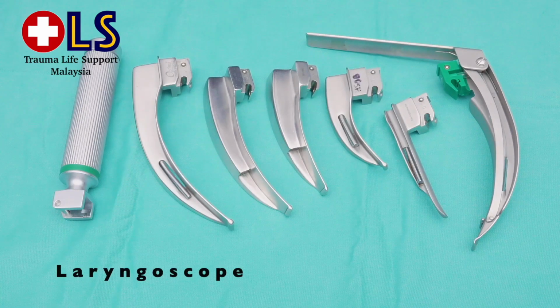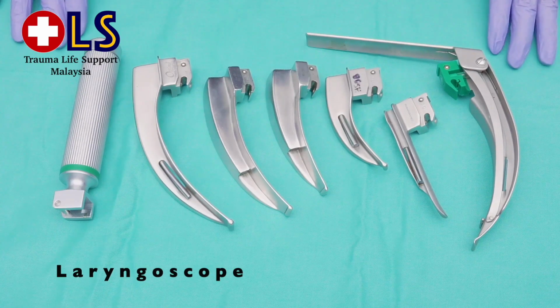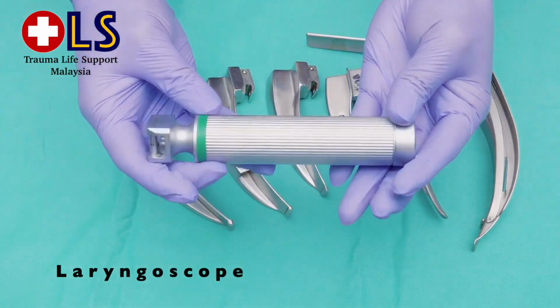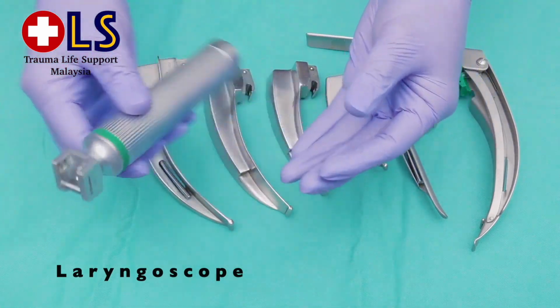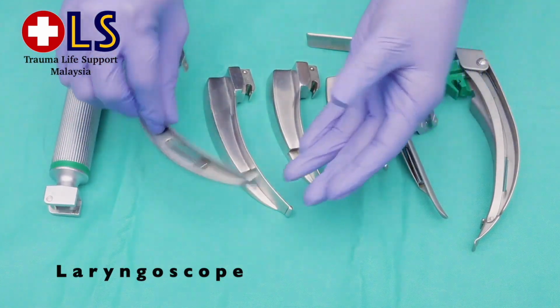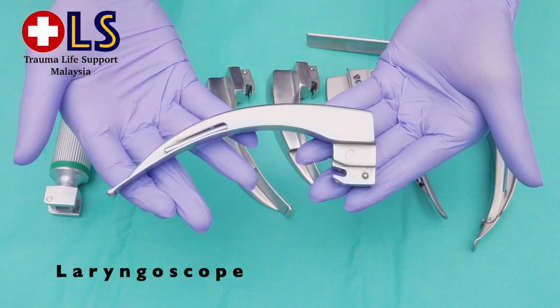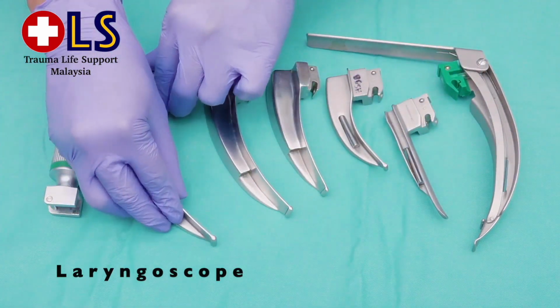This is a laryngoscope. It has two parts, the handle and the blade. There is normal handle and there is short handle.